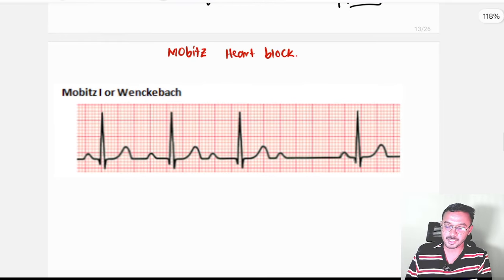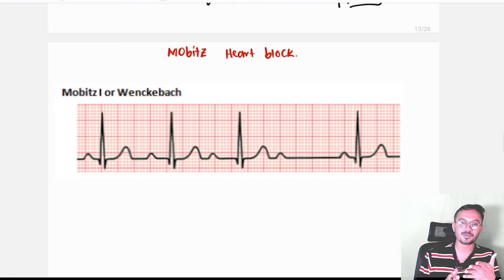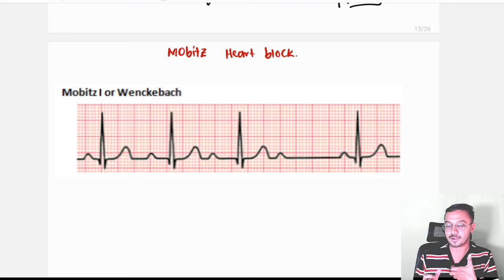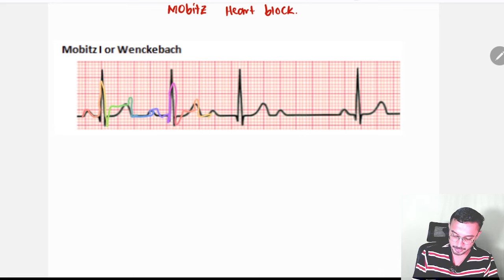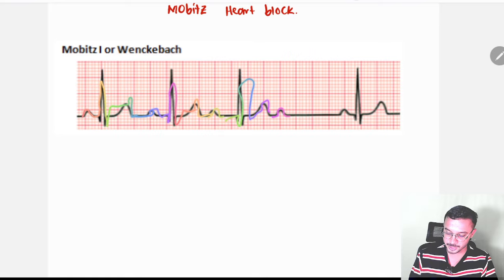So when you come to the exam hall, if you go through the options like Mobitz 1 and Mobitz 2, I will teach you how to differentiate between them. P, Q, R waves, P wave, QRS and T, P wave, QRS and T, everything is normal. Until here everything is normal.